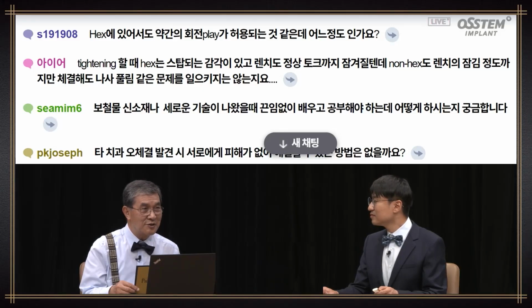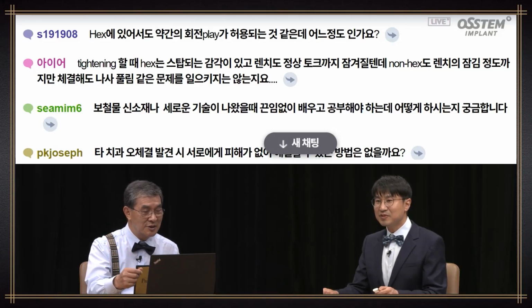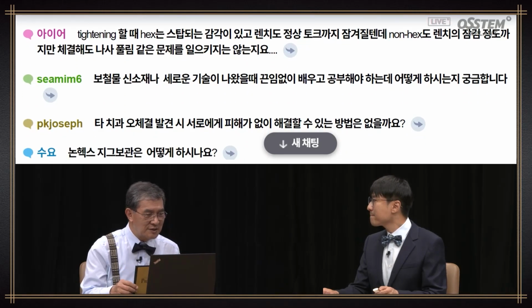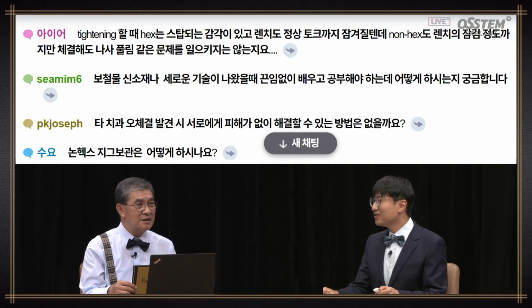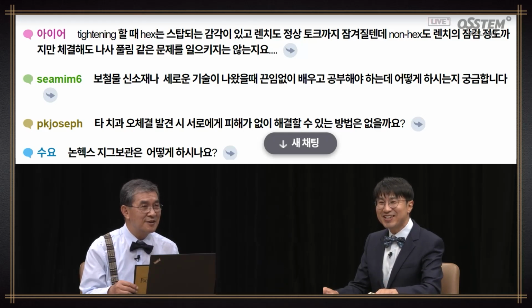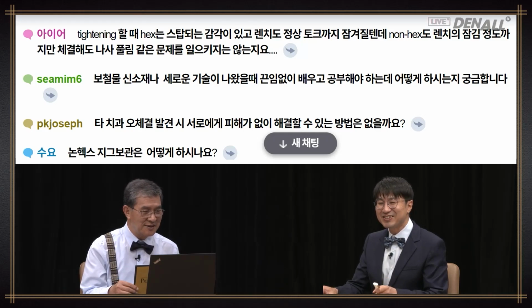Even if there's hex, at times it can rotate. You talked about the gap within hex type earlier. When you do tightening, the hex, you can sense that it is stopped and you use the wrench with normal torque. In the case of non-hex, will there be no screw loosening if you use a wrench and apply normal torque? I actually prepared for this question as well.